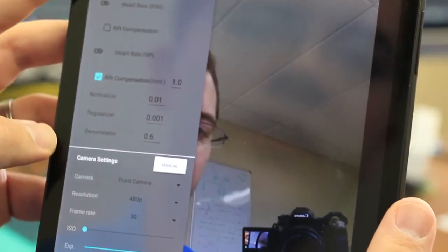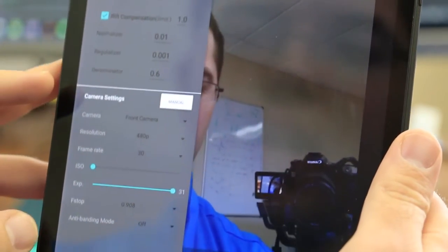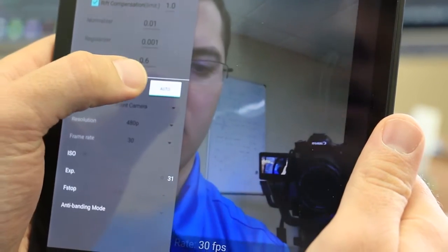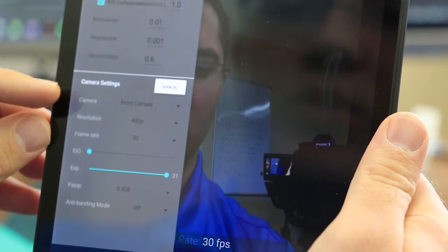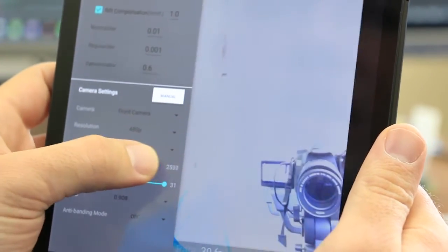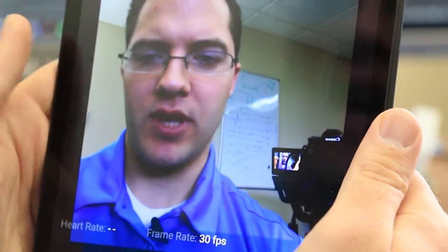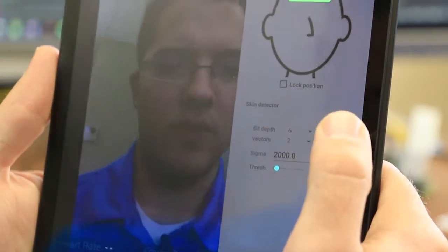I have the algorithm settings, which I'll come back to in a minute, and here at the bottom I have camera settings. I'm able to toggle between manual or auto mode. This is the auto recording mode. I think I'm going to stick here in manual. I can switch whether I want front or back camera, resolution, frame rate. I can even change things like the ISO on the fly or the exposure time and a couple other settings. I think we're pretty happy with what we have there. Let's take a look at our acquisition menu.